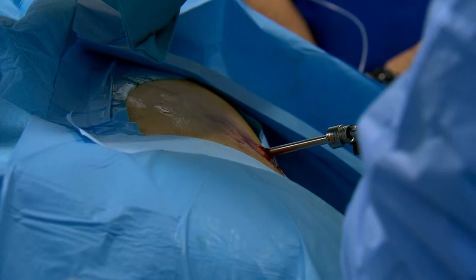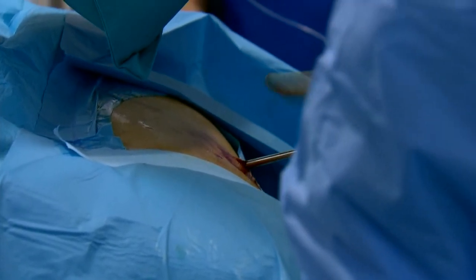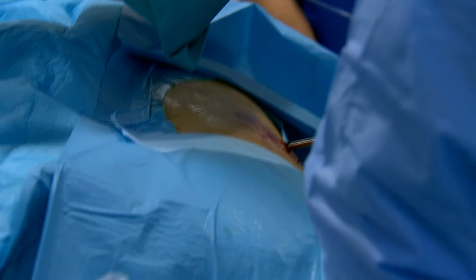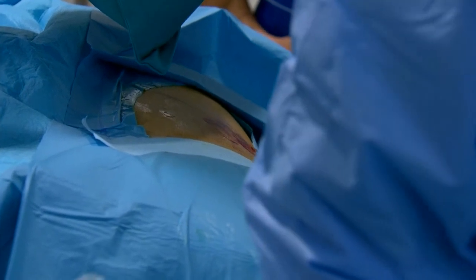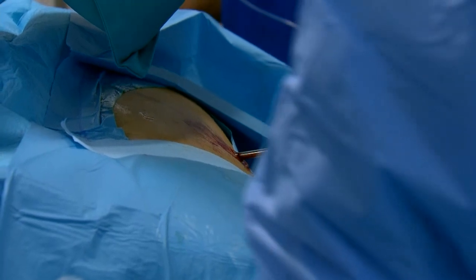How do you rotate this? You rotate just like this. Always like a half circle. Forty degrees. No, more than that. This is to avoid a sudden movement, so as not to injure the kidney.